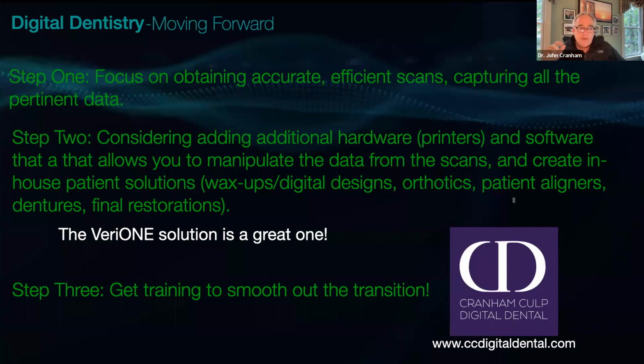Now, what I found to be the absolute best for an orthotic is that we will use a leaf gauge, and we will put enough leaves in there between the teeth and get them back into centric, but set the vertical with the leaves. So I look back in there, and I like to have the teeth apart at the vertical that I want the splint to just fill in the space.